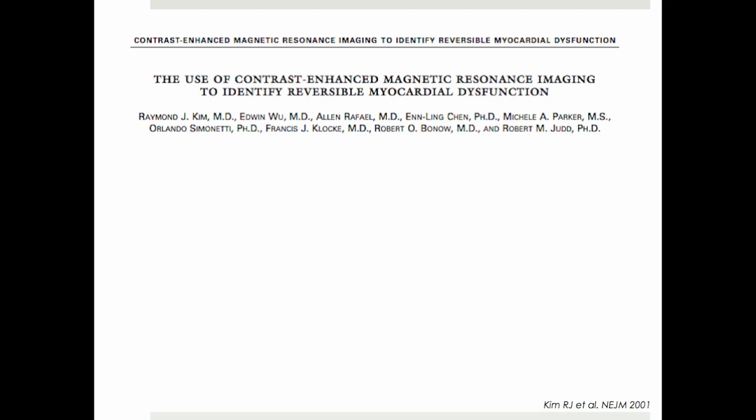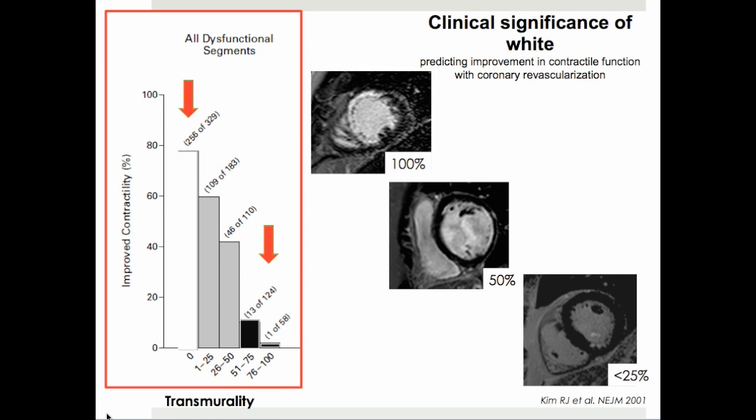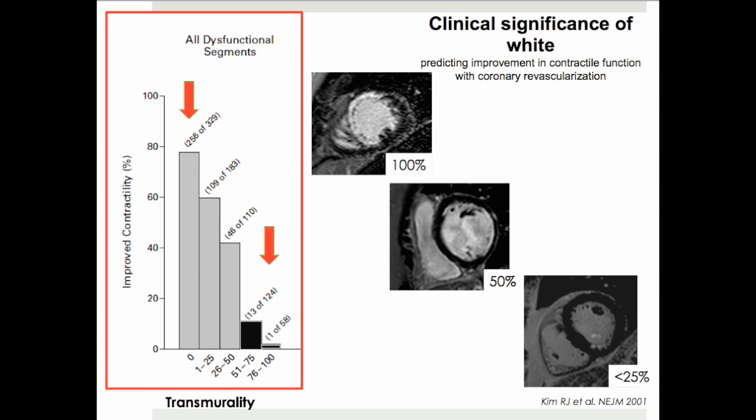That is, whether myocardial tissue that is impaired, hypokinetic, and dysfunctional stands a chance of recovery with revascularization, something that is highly dependent on the transmurality of myocardial infarction. Whereas improvement can be expected in partial thickness myocardial infarction, a full thickness scar is unlikely to recover.